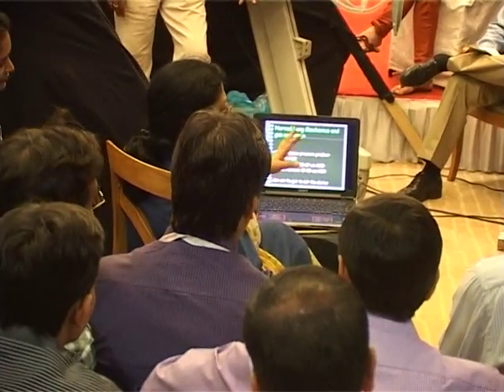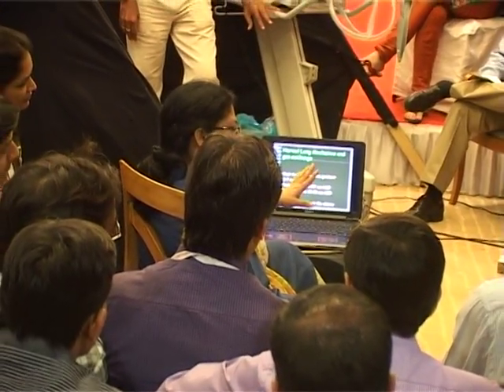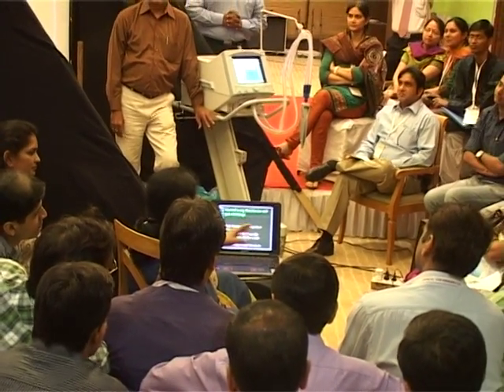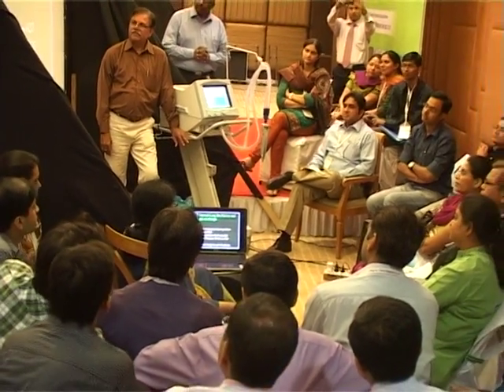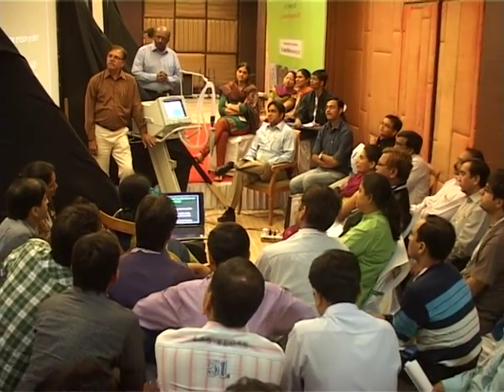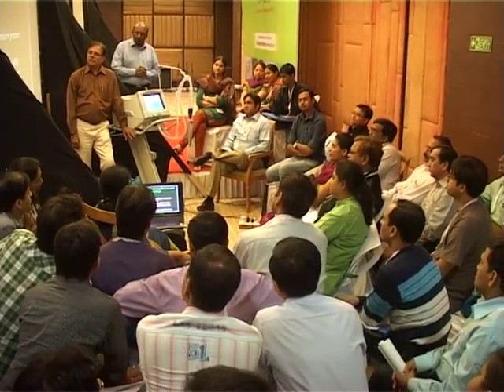Anytime anybody goes on a ventilator, BP will drop. So you may have to give some amount of volume. Okay? The peak pressure gradient will be normal in this. Lungs are normal. Peak pressure is not high, pause pressure is not high.